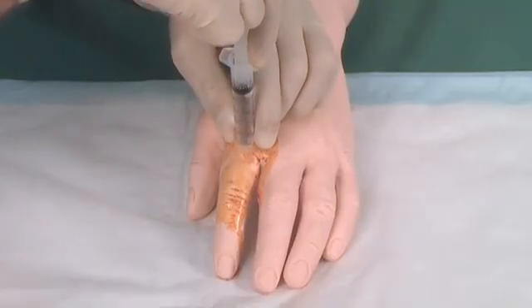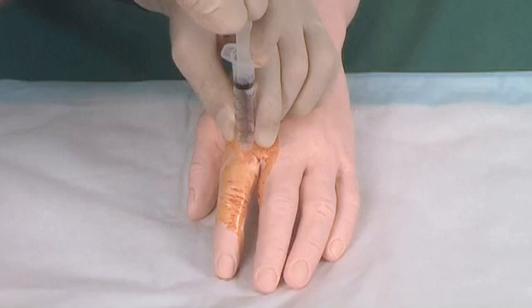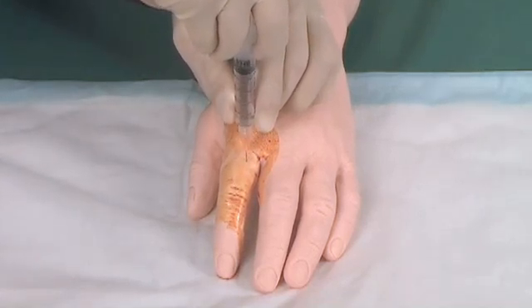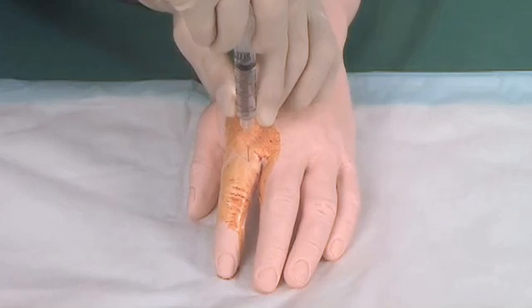Aspirate to ensure that the needle is not within a blood vessel, and slowly infiltrate 1-2ml of lignocaine while withdrawing the needle completely.